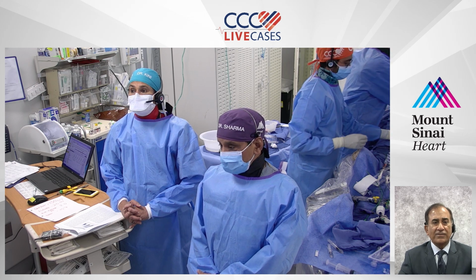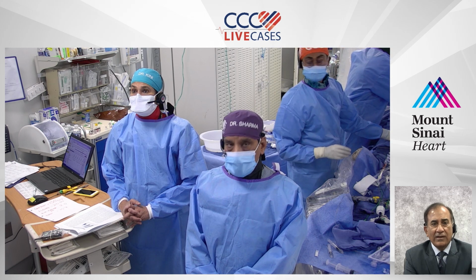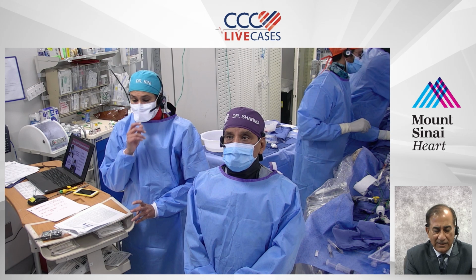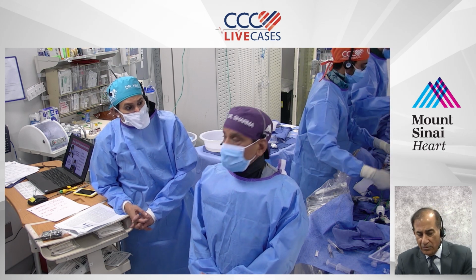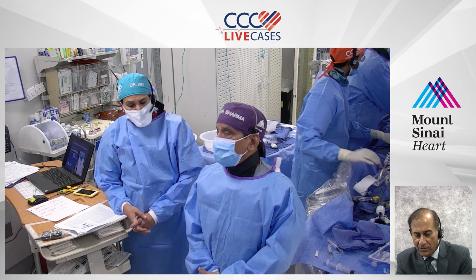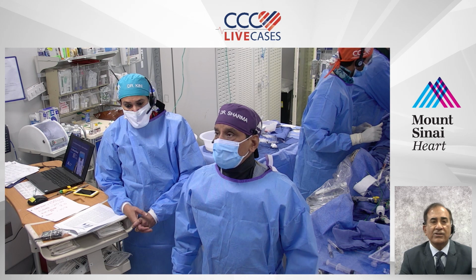I have referred all of them to the app, where almost all the cases highlight the wire escalation strategies. Can you ask the questions? What are they asking? The one question was, if you could not cross, what would you use? What is the strategy to use if the microcatheter would not have crossed?